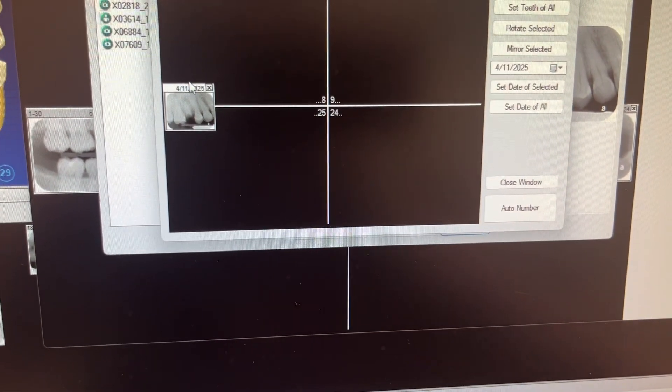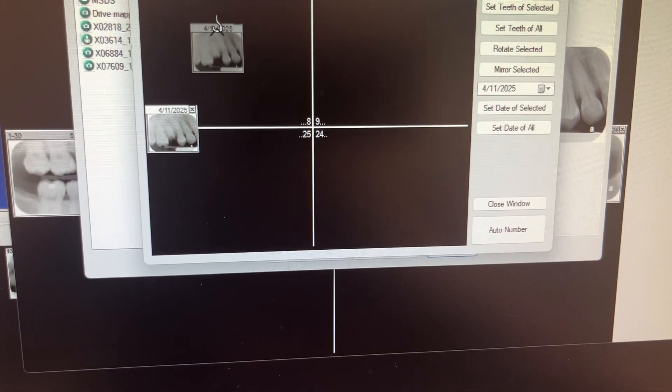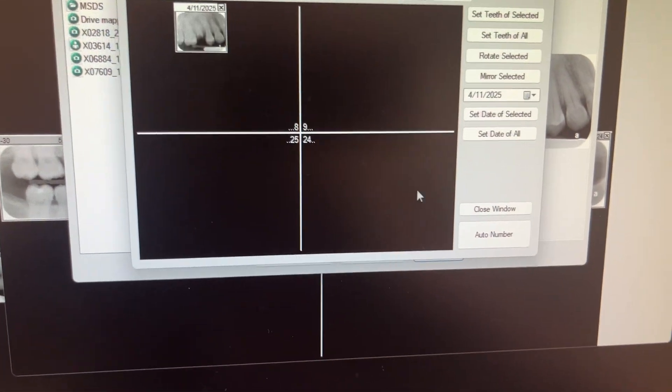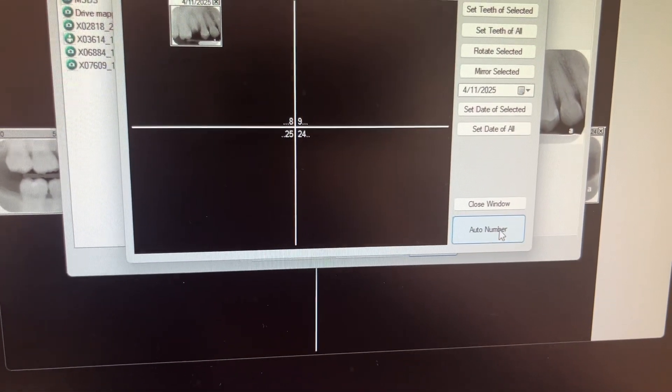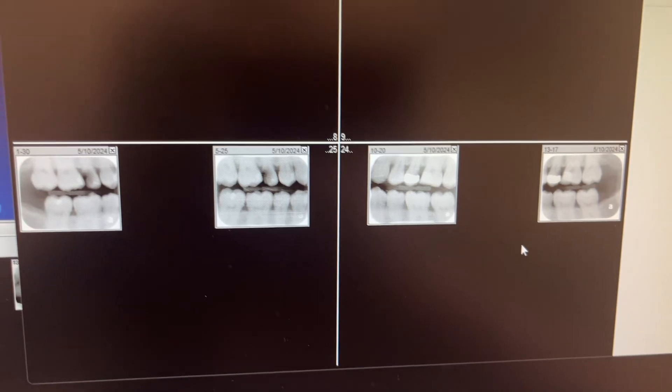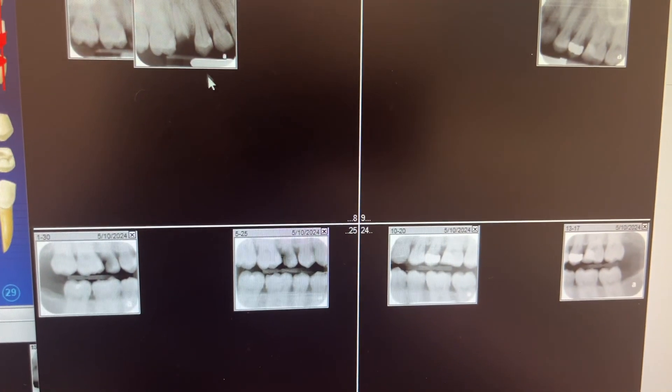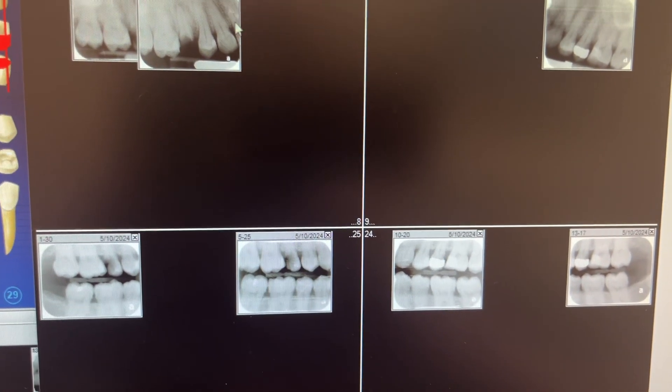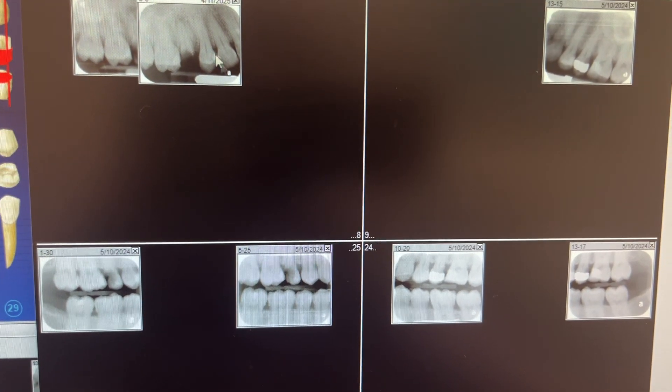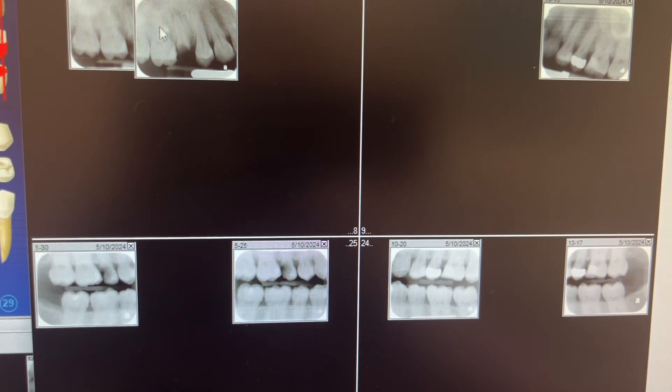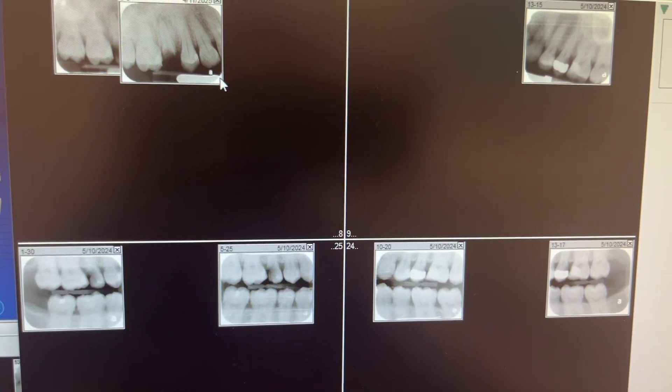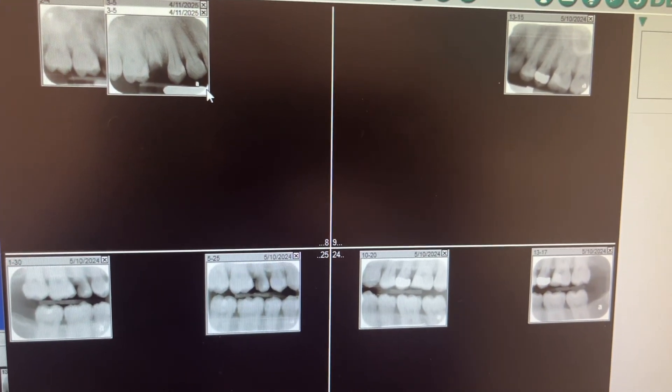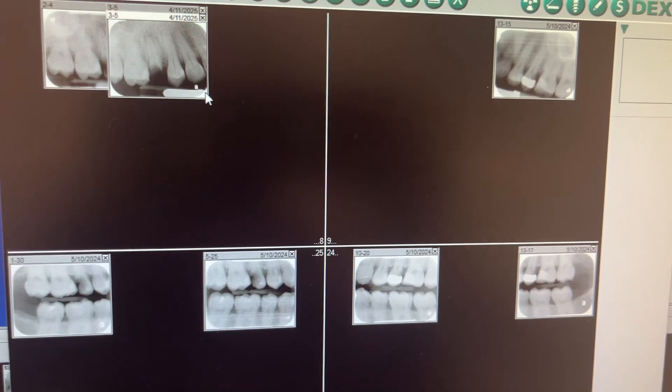It's going to ask you to auto number it. You're going to put it right there. You're going to auto number it because it's tooth number four. And then there it is in your x-rays now. And so now you have it from the old chart into the new chart.